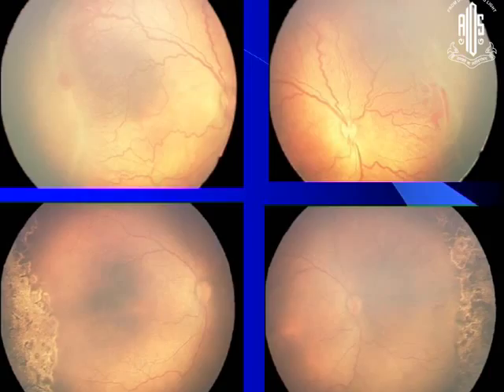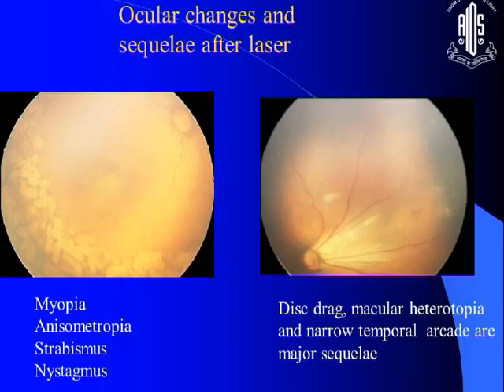This is another one, again fairly severe disease. You can see these vessels, they straighten up, they are no more dilated. And this is a picture which Anand has taken. He has taken this montage right up to the ora serrata. He has taken the whole thing here. So you can even create a montage like this, and you may have sequelae which might happen like this, or infants are coming late.